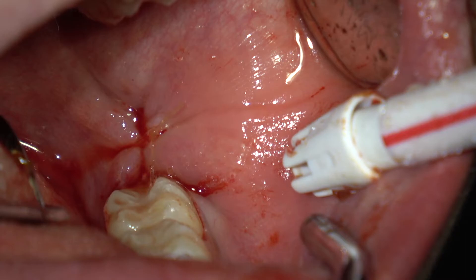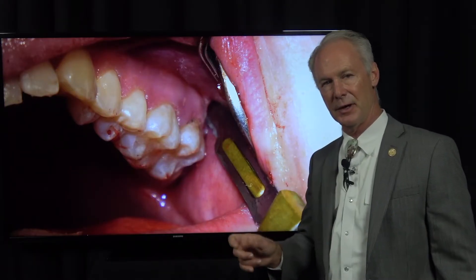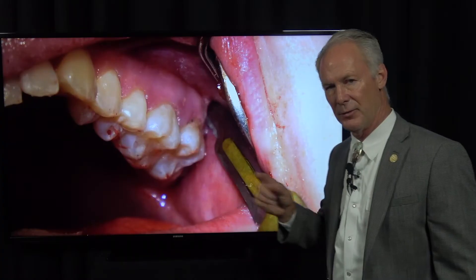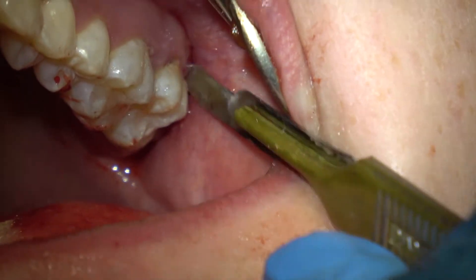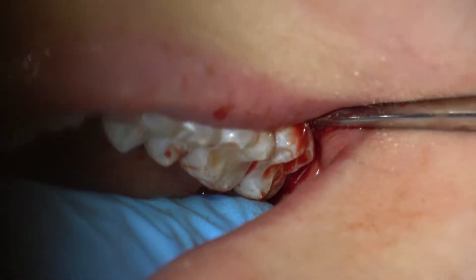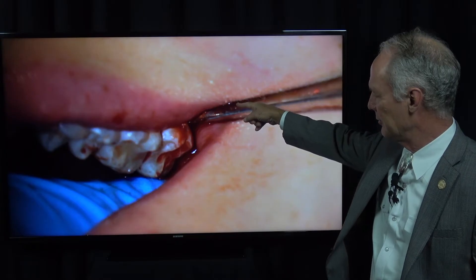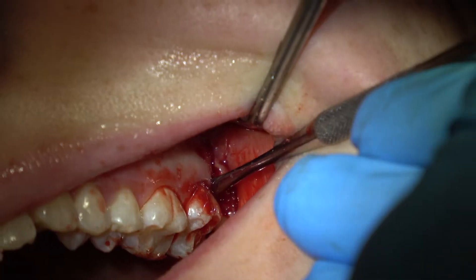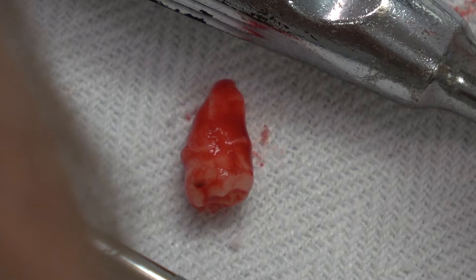You can see I've got one suture there and one there. Now with each of these I'm giving an intraligamental injection with a 30-gauge needle and Citanest S4. It's very important that you inject intraligamentally or you probably won't get these teeth numb. Refer to that link on how to give a painless and profound dental injection. Then I'm making a distal buccal vertical incision off the distal buccal of the second molar, then placing an elevator between the distal of the second molar and the mesial of the impacted third molar and just rotating it out. Be sure to protect the airway — those are pretty simple extractions.